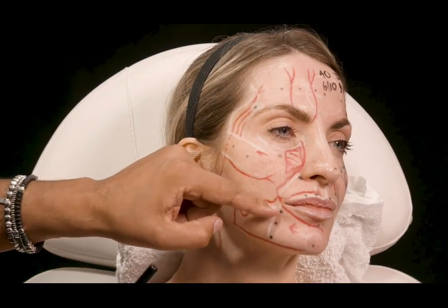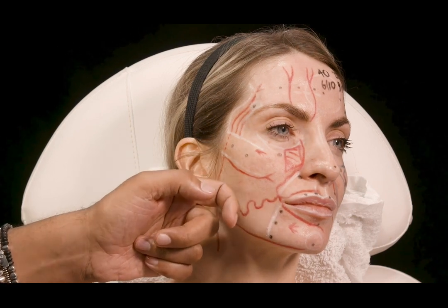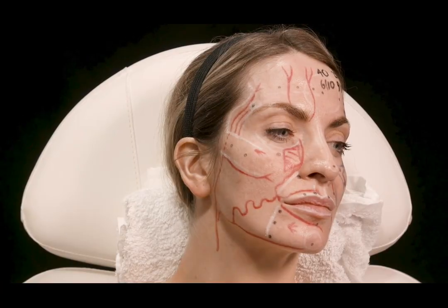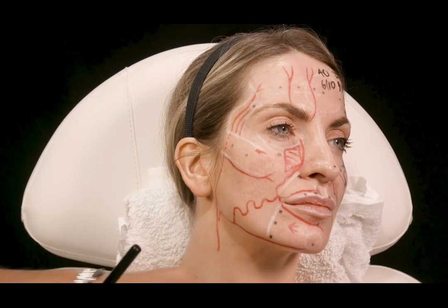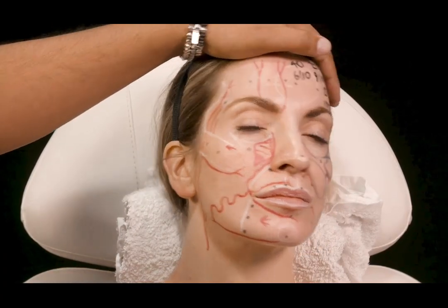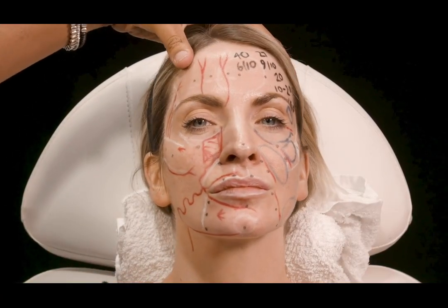When we're injecting the oral commissure, we need to keep it in the subq, so over the top of the orbicularis oris muscle, so as to not prang the inferior labial artery. The midline of the chin is actually exceptionally safe. I mean, there's just no vessel there, but you want to try and place the product between the two bellies of the mentalis muscle really for accurate delivery.